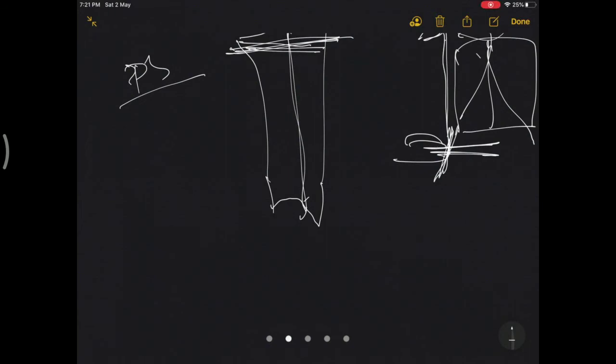Okay, so this is a simple case, which is what happens most of the time. You have a patient with a correctable varus, so there are no issues with the soft tissues, and not much gap balancing is required. So you will do what I am going to explain now.